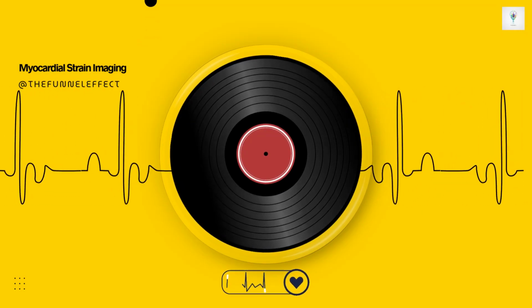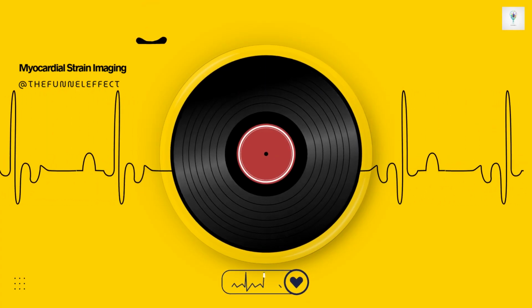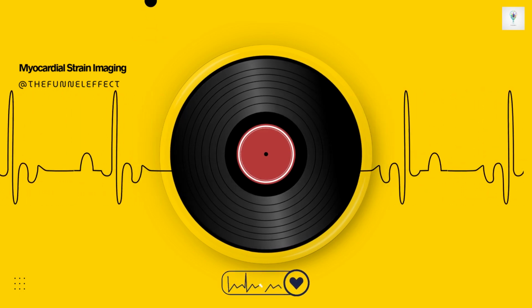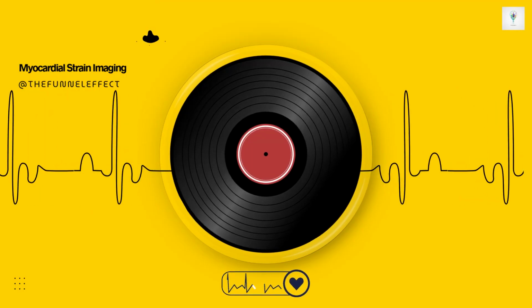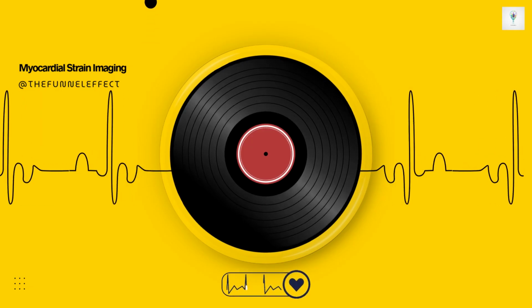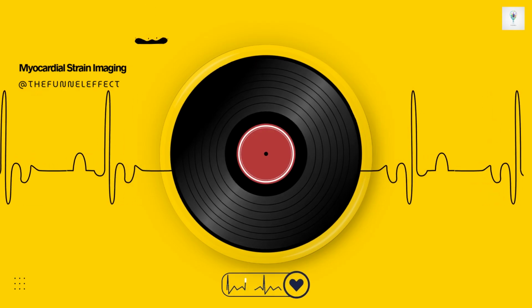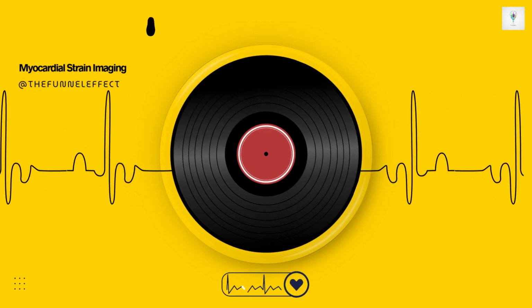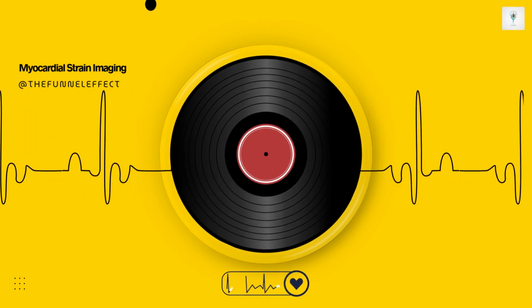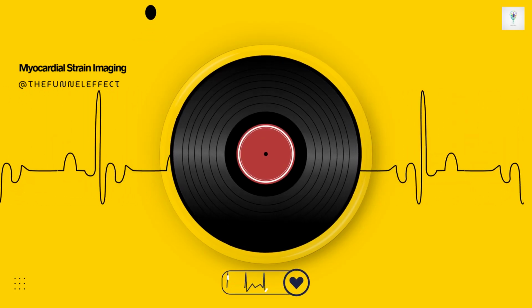Gotcha. First, the measurement variability is still quite high, especially given the thinness of the layers and the limits of current image resolution. Second, technically, the radius of curvature of the LV in the long axis is quite large, meaning the actual length difference between the inner and outer layers isn't that dramatic, making it hard to track reliably. Okay. And maybe most importantly, the myocardial layers aren't independent, they're mechanically tethered together. Dysfunction in the inner layer is almost immediately reflected, even if slightly attenuated, in the motion of the outer layers. So while research continues, routine clinical layer-specific LV strain isn't quite ready for prime time.